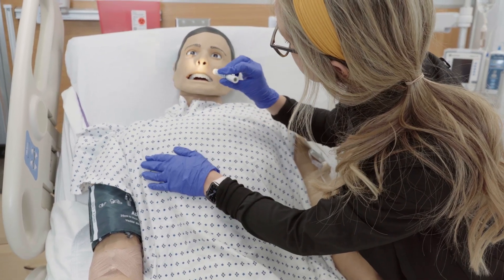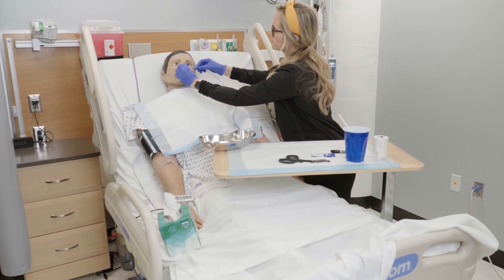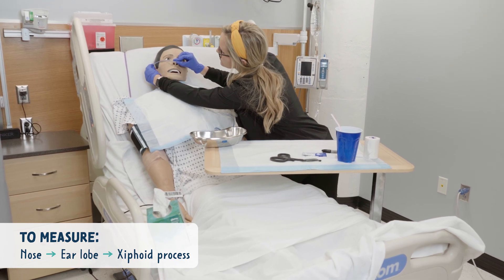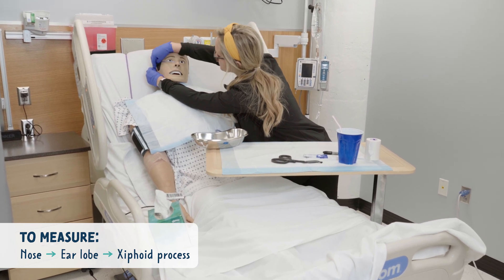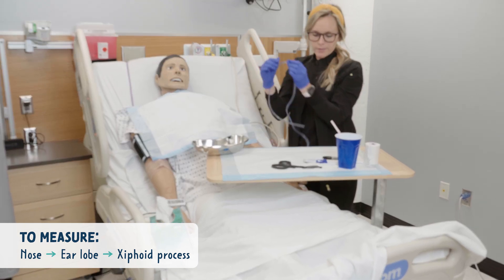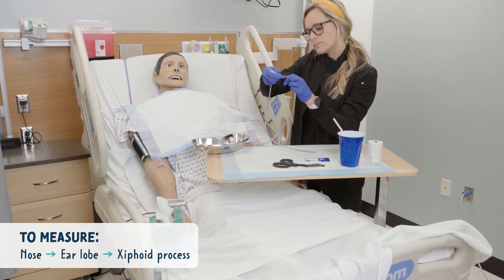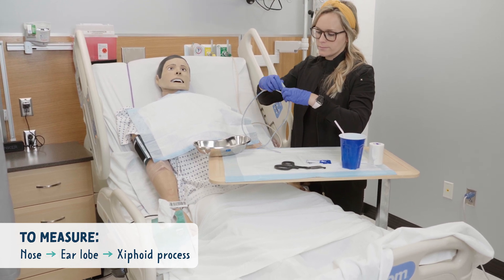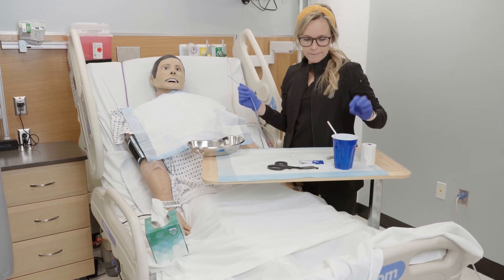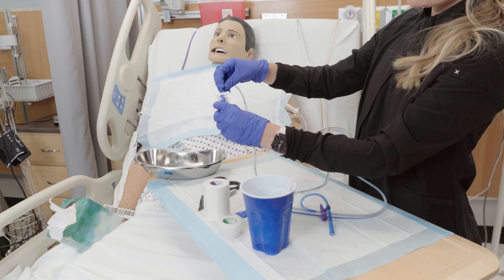We need to measure how far to put the NG tube into the patient. We do this by taking the tip of the tube and placing it on the patient's nose, then from the nose to the earlobe, and from the earlobe to the xiphoid process. Mark this location with a sharpie or a piece of tape — this tells you how far to insert the tube to reach the stomach. Last, lubricate the tube about 4 to 8 inches before inserting it.